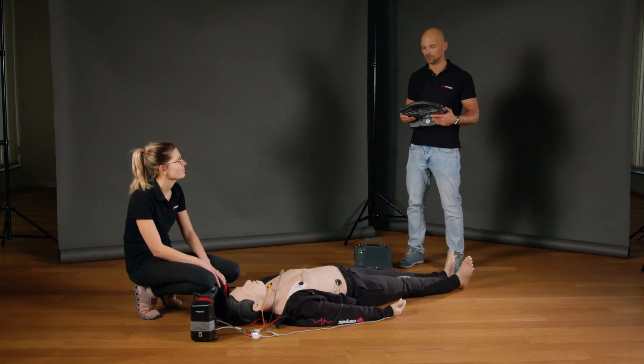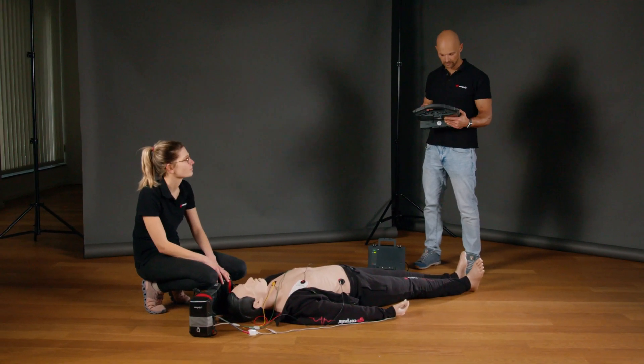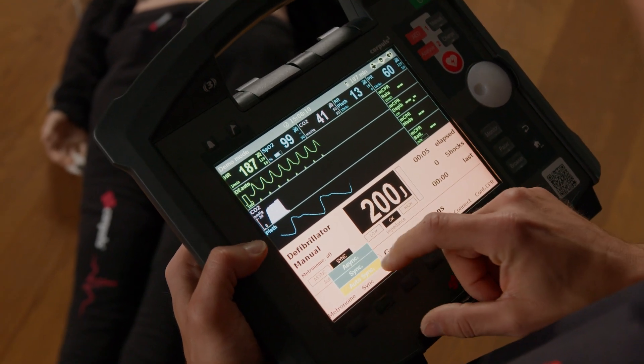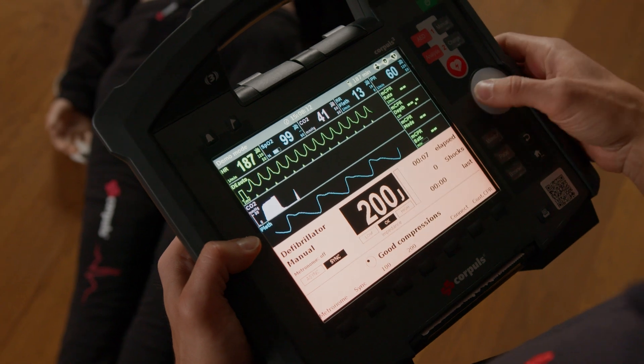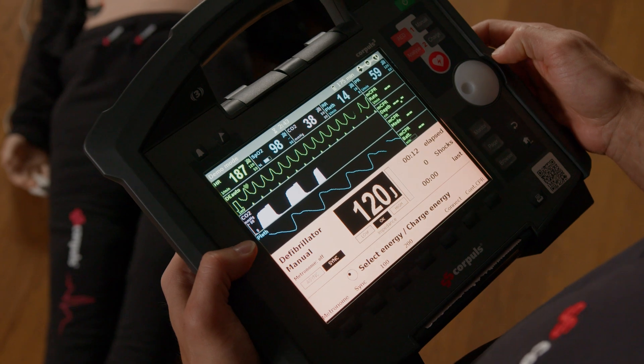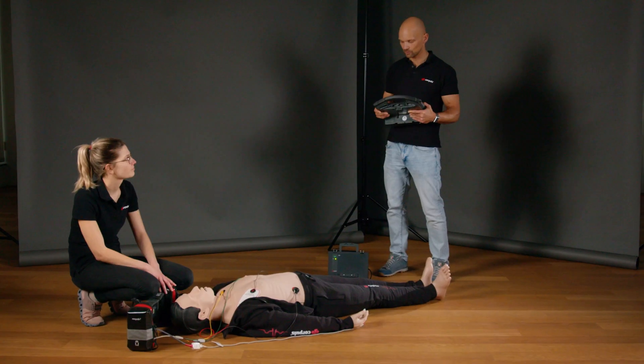For cardioversion, I will switch to manual therapy mode. Now I can select R wave synchronization by pressing the sync button. We are now setting the cardioversion energy — here, as an example, 120 joules of emergency cardioversion.